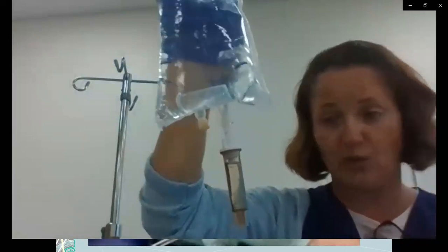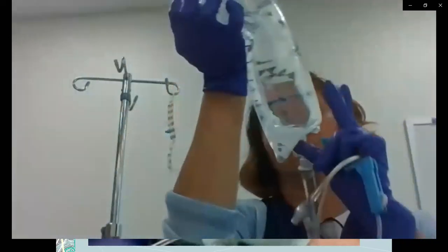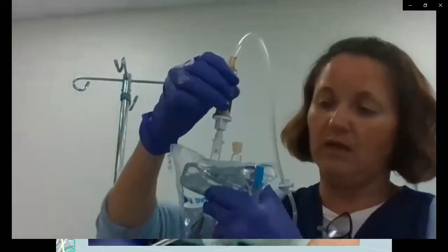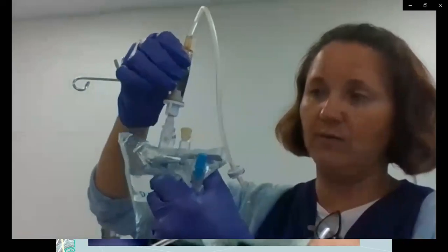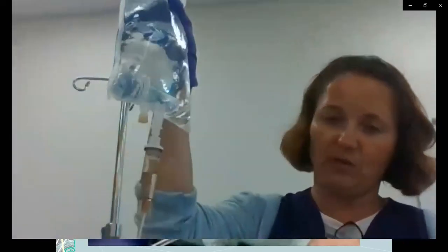If you do accidentally squeeze too much in your drip chamber, you want to be able to see it dripping. So this isn't going to work. But all you've got to do is take it, flip it upside down, and squeeze some of that back into this bag. Okay? So now we're back to about halfway.